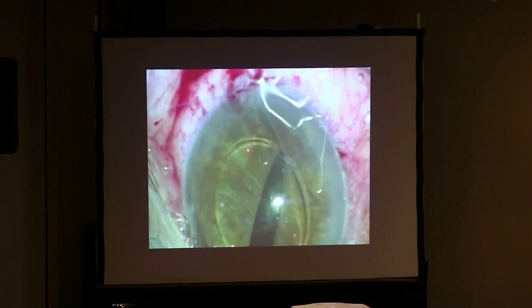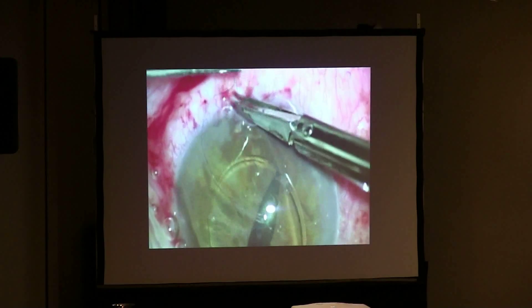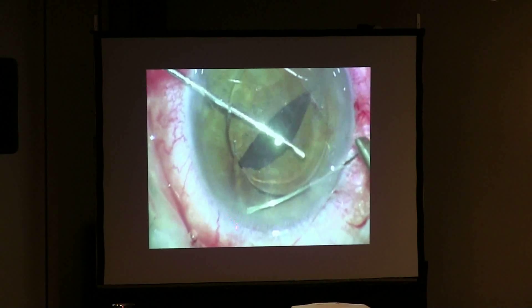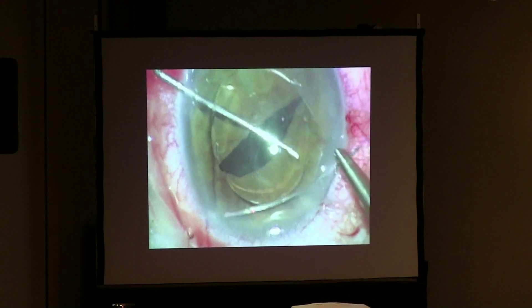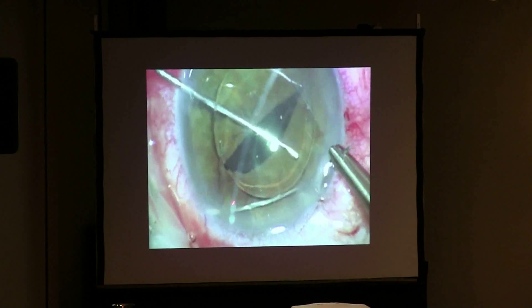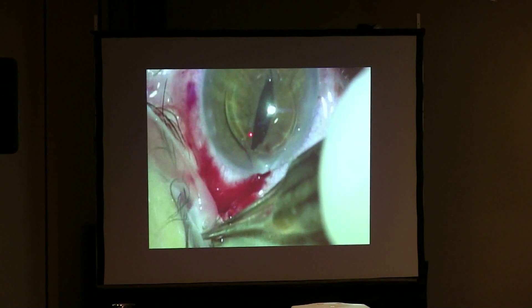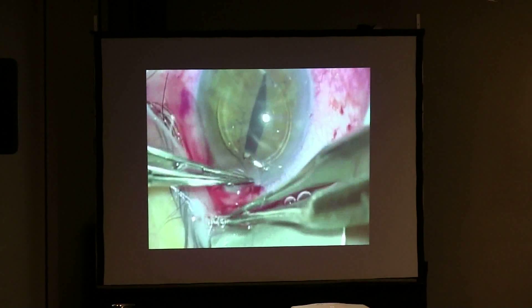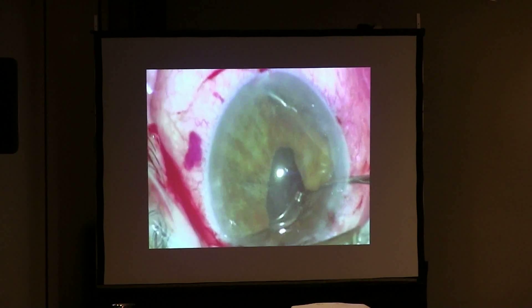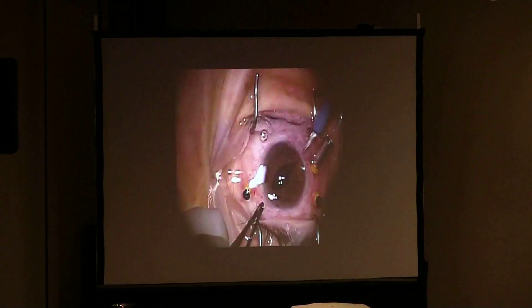You go through the iris, under the haptic — you do not need a whole lot of iris tissue. If you take a big piece, you'll have a cat eye appearance and distort the pupil. You also want to go to the mid-periphery, not very central, so you do not distort the shape of the pupil. Once you push it back in, the lens is in and the pupil is rather centered. You can do this in conjunction with retina surgery or trauma surgery.